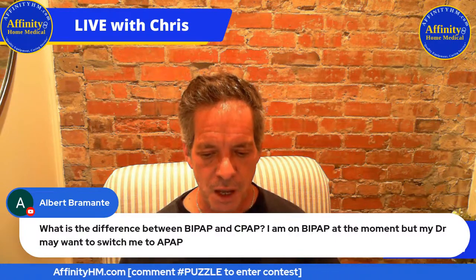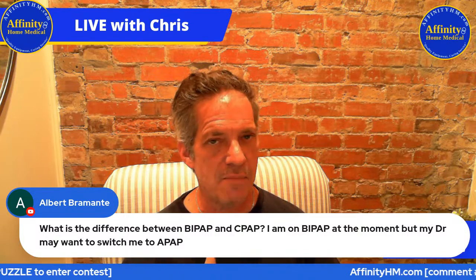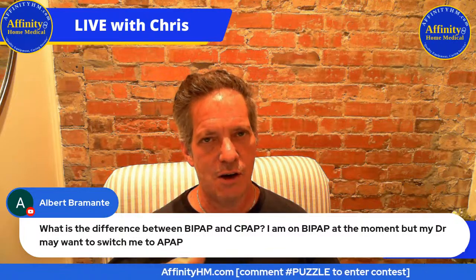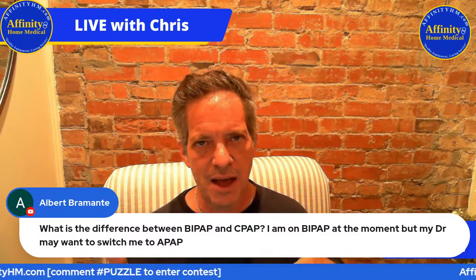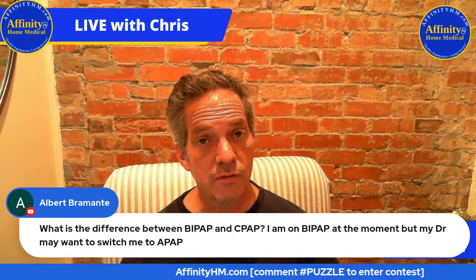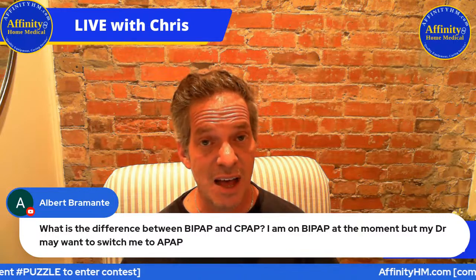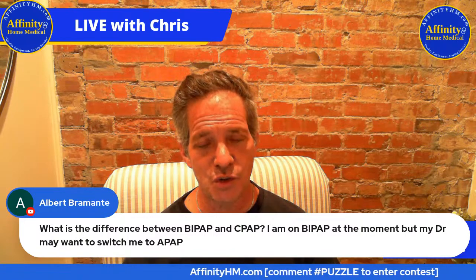Here's the difference. With either a CPAP or an APAP, the pressure is the same when you're breathing in and when you're breathing out. So you feel this resistance when you're exhaling with a CPAP or an APAP. And for some people, especially on high pressure, that is just too much resistance. It can be uncomfortable for some people. So the doc will switch them to BiPAP. And it would typically be covered if you've already tried CPAP and it wasn't working out. Typically, insurance companies do cover BiPAP in that situation.